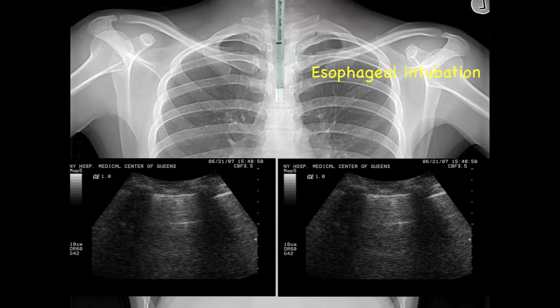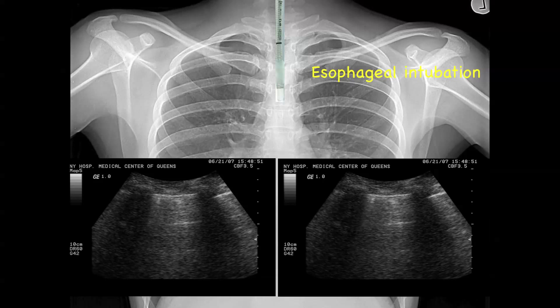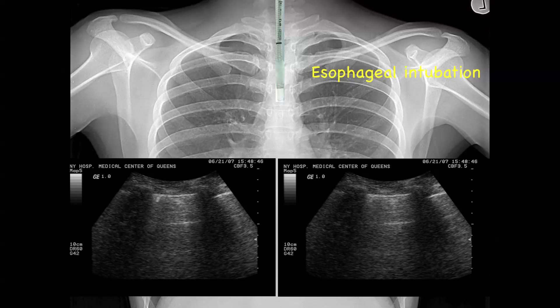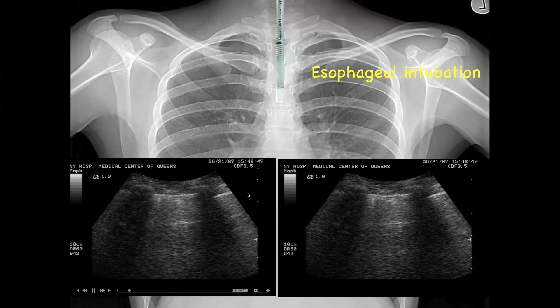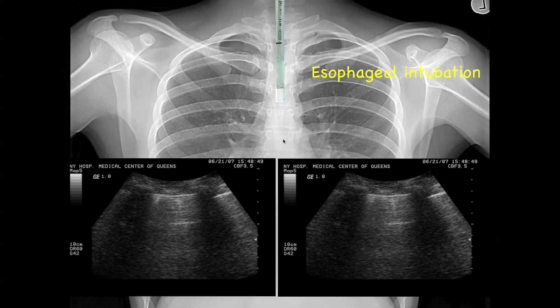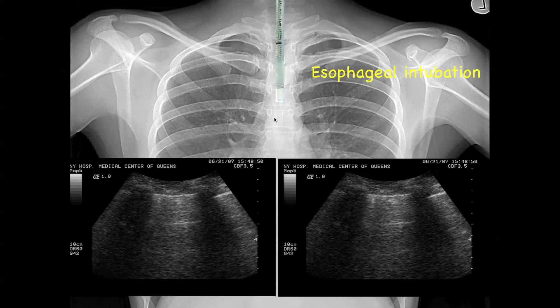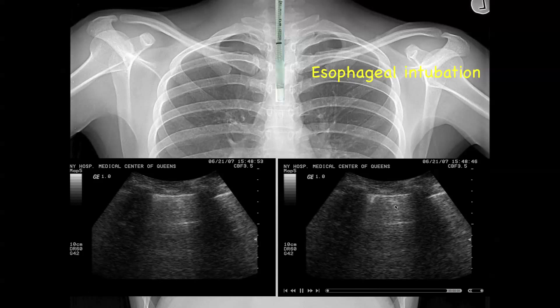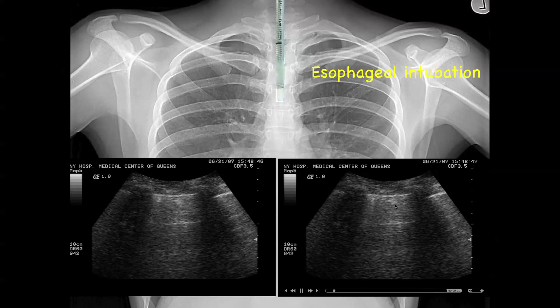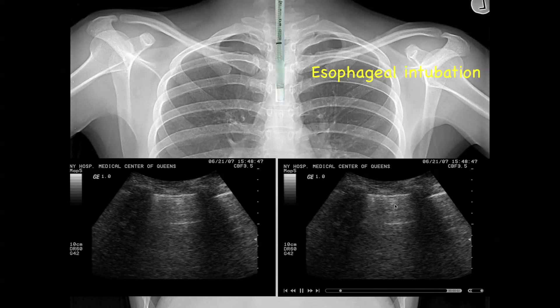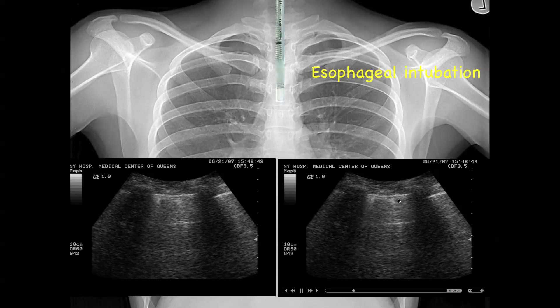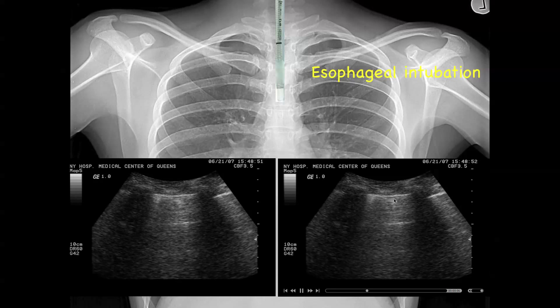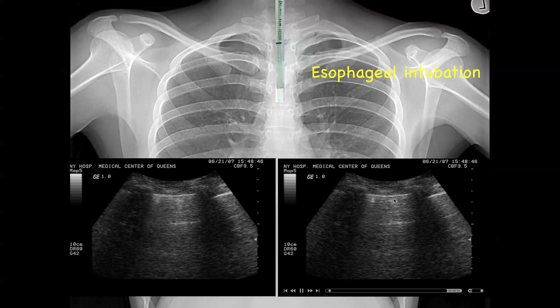This represents an esophageal intubation. If you intubate and their sats don't come up, there are good studies showing you can put the probe on the trachea and watch the tube go through. Or you can simply put it in the chest and see that there's no lung sliding — you get this lung pulse sign and you know you're in the wrong spot.